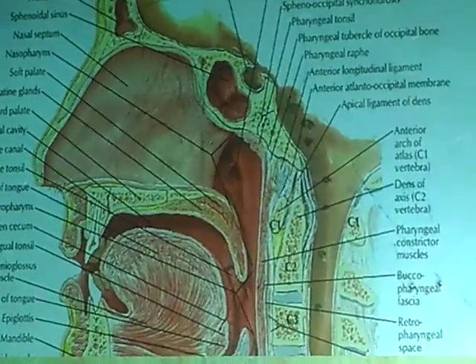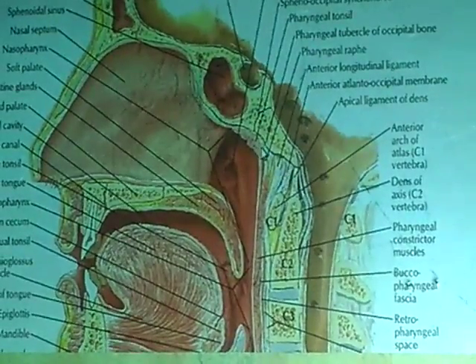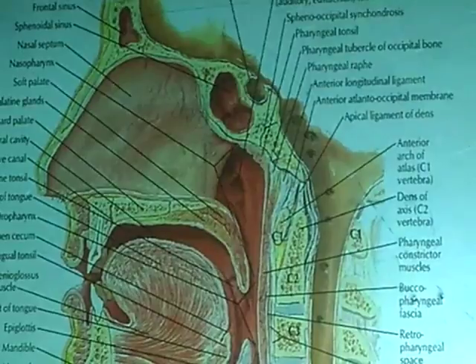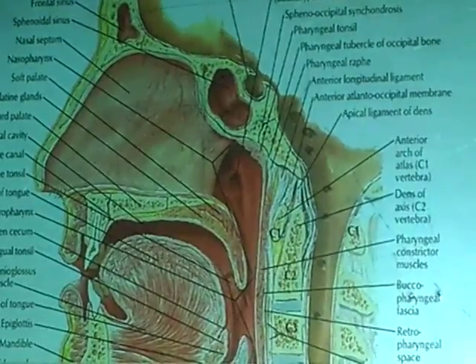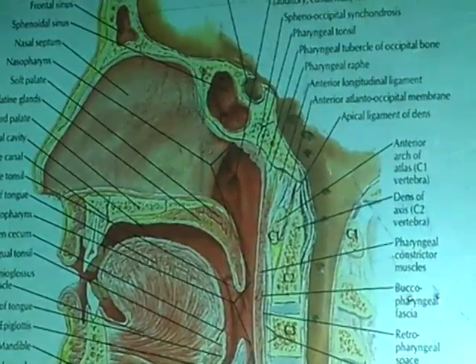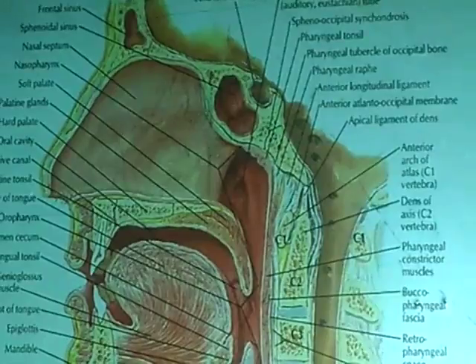first cervical vertebrae. So what lies beneath us, beneath the lymphoid tissue, is this part of the bone, which is the basilar part of the occipital bone, covered by the pharyngobasilar fascia. So when you are curetting the adenoid, you know that you are actually going to remove the mucosa covering the adenoid, and then you are going to remove the adenoid tissue, and then your underlying tissue will be the bone covered by the pharyngobasilar fascia.